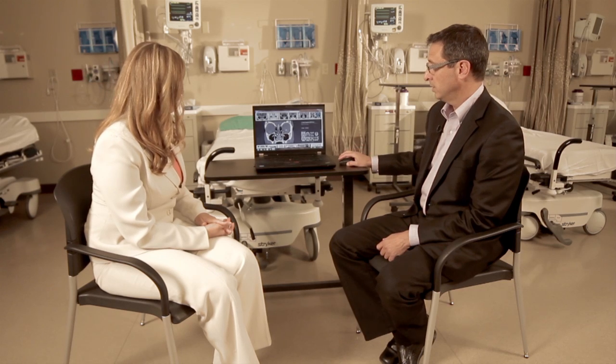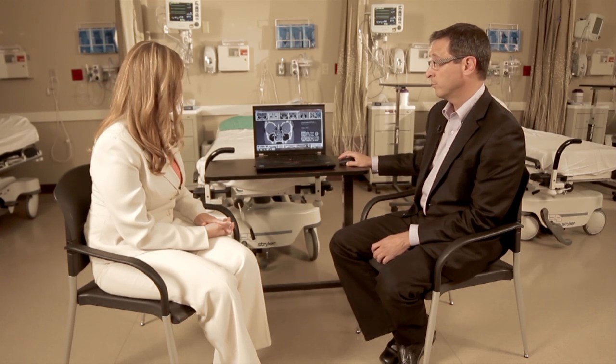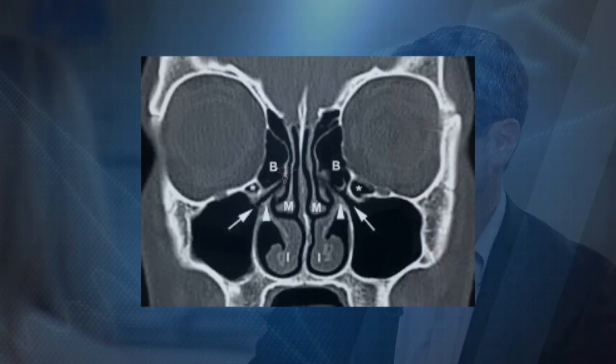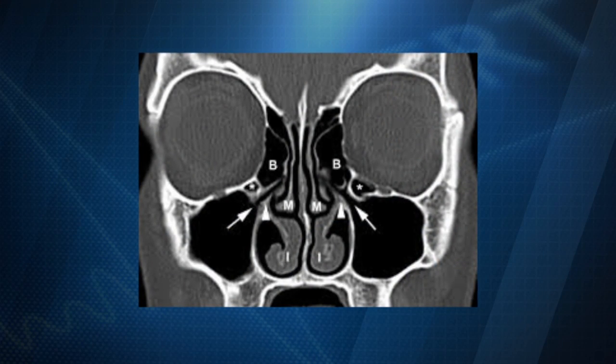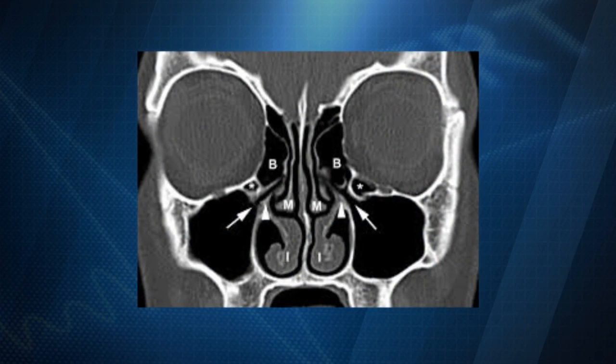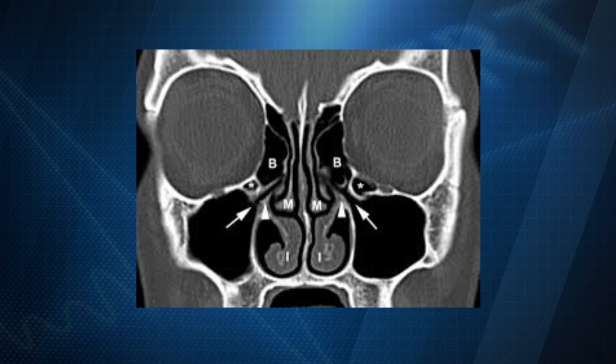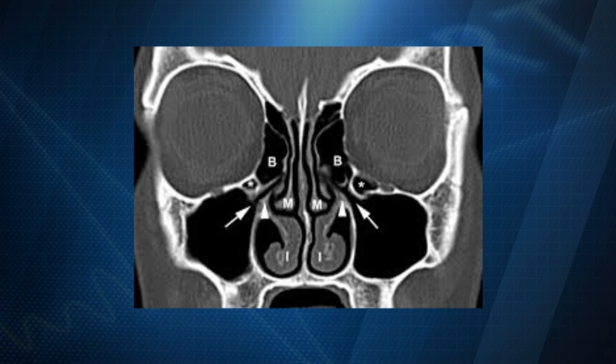I have a CAT scan here we can discuss. This is an example of someone who has healthy sinuses. Here's the wall, which is the septum. These structures that I'm pointing to are called the turbinates — they help to warm and moisturize the air. Here are the eye sockets and here are the sinuses. They're called paranasal sinuses because they live next to the nose.